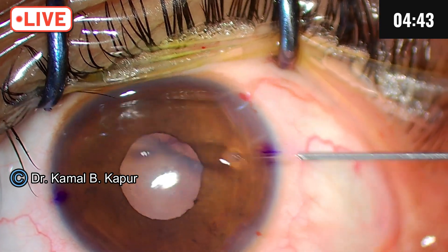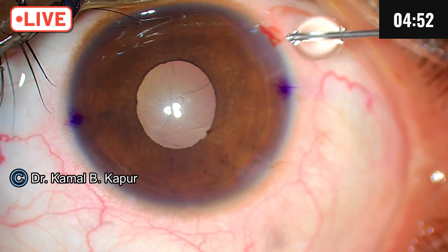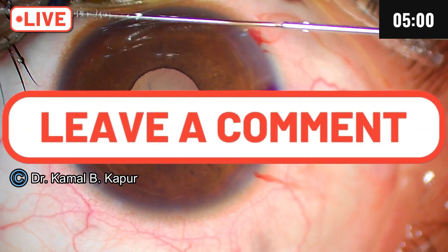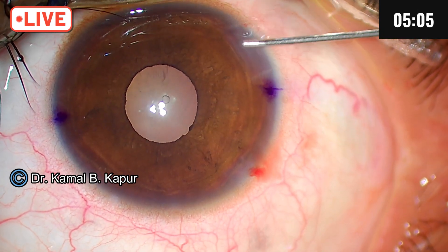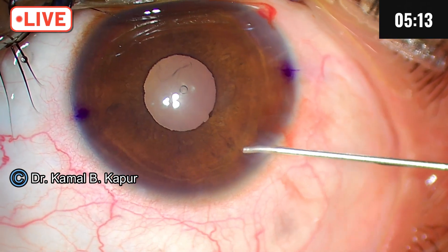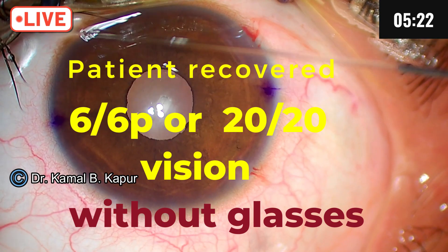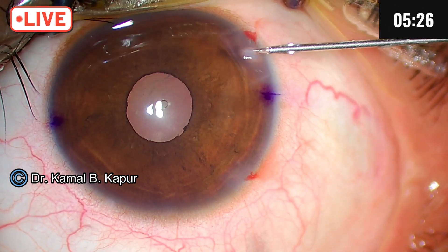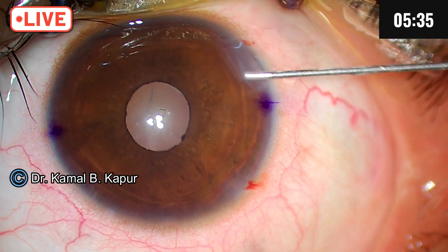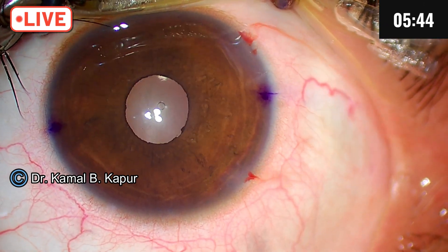Planning a slightly higher vault in these cases is a good idea because the astigmatism is very high, and even a slight rotation can cause visual disturbance. I plan one size higher in IPCL — 0.25 millimeter higher than I would normally — which gives a very secure and stable vault and stable refraction over time. The surgery has gone off perfectly. We already operated the other eye and the patient is 6/6 in that eye. It was a similar power, approximately minus 5 with seven diopters of astigmatism. The patient is practically spectacle-free now. Thank you.